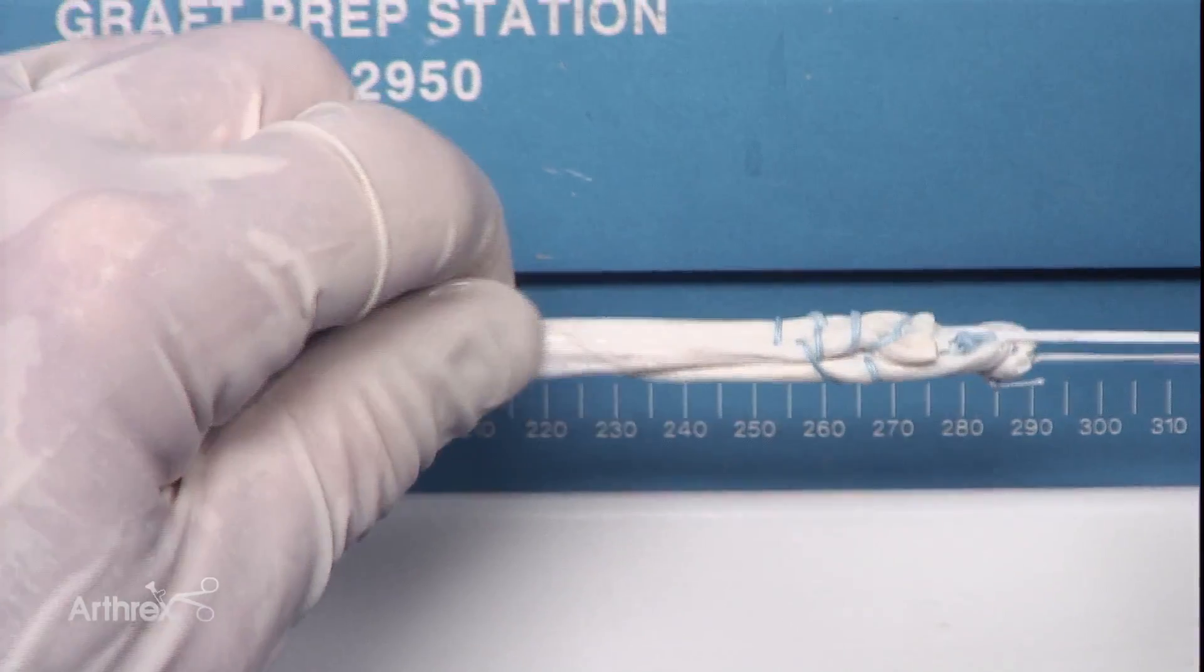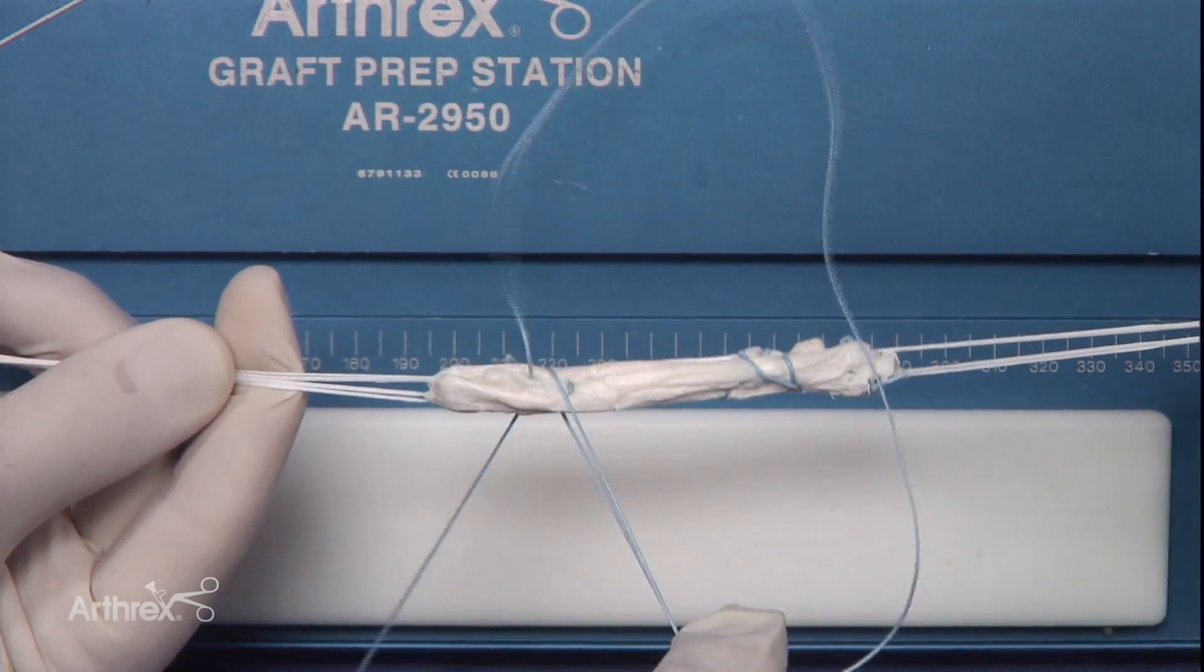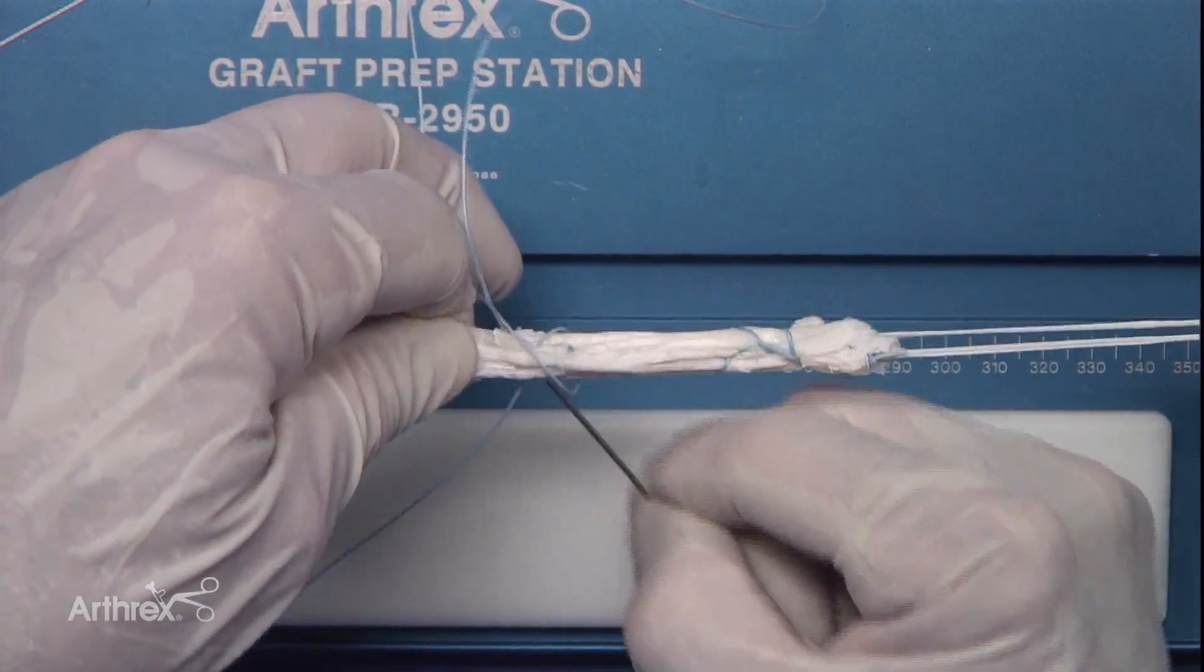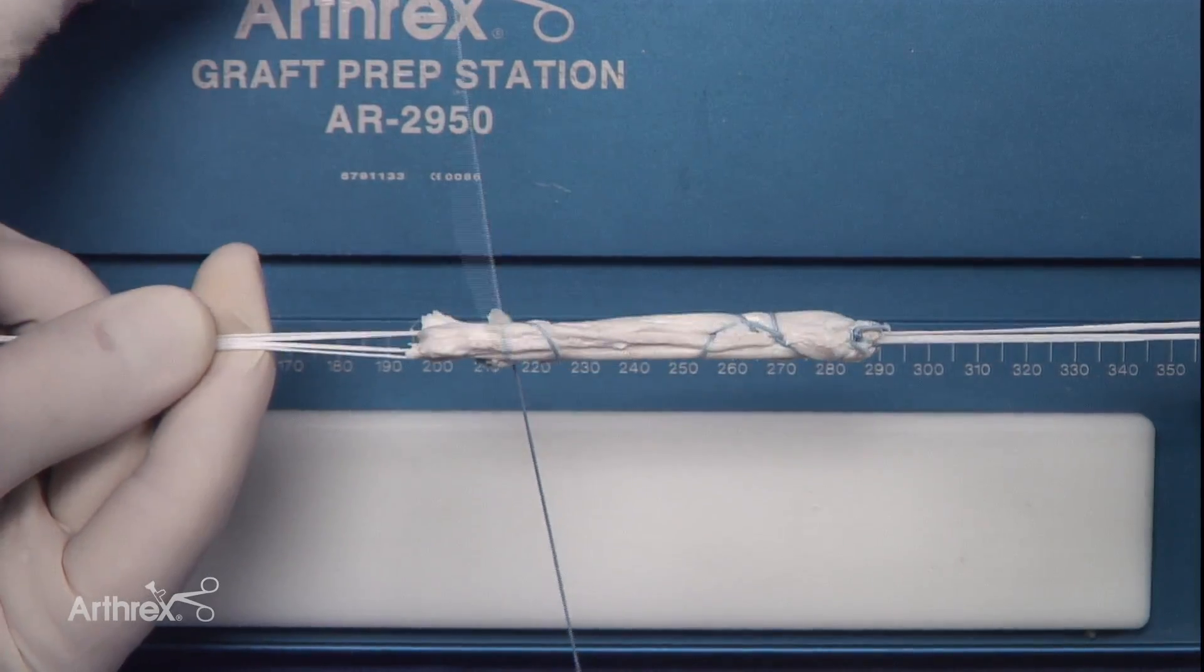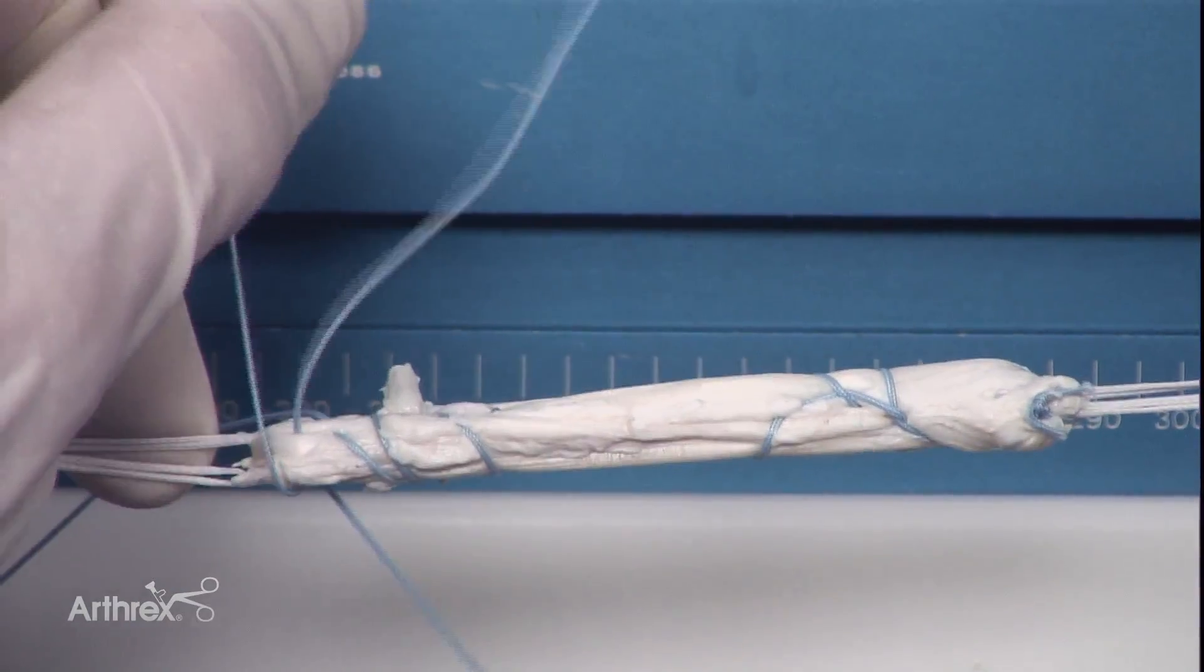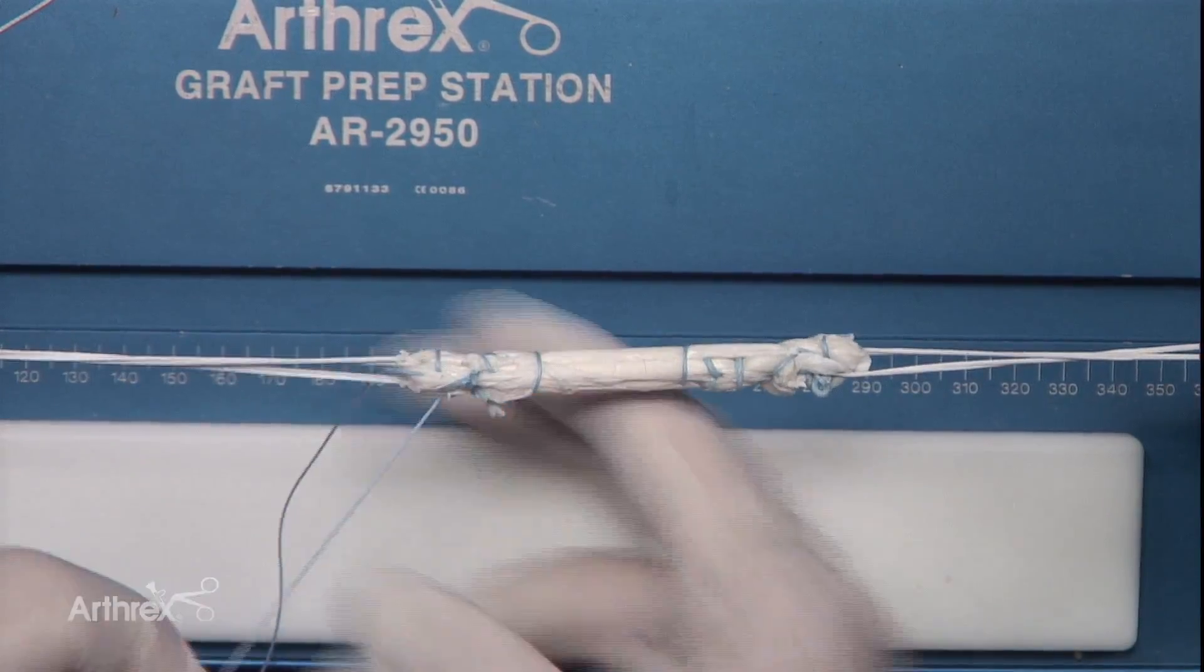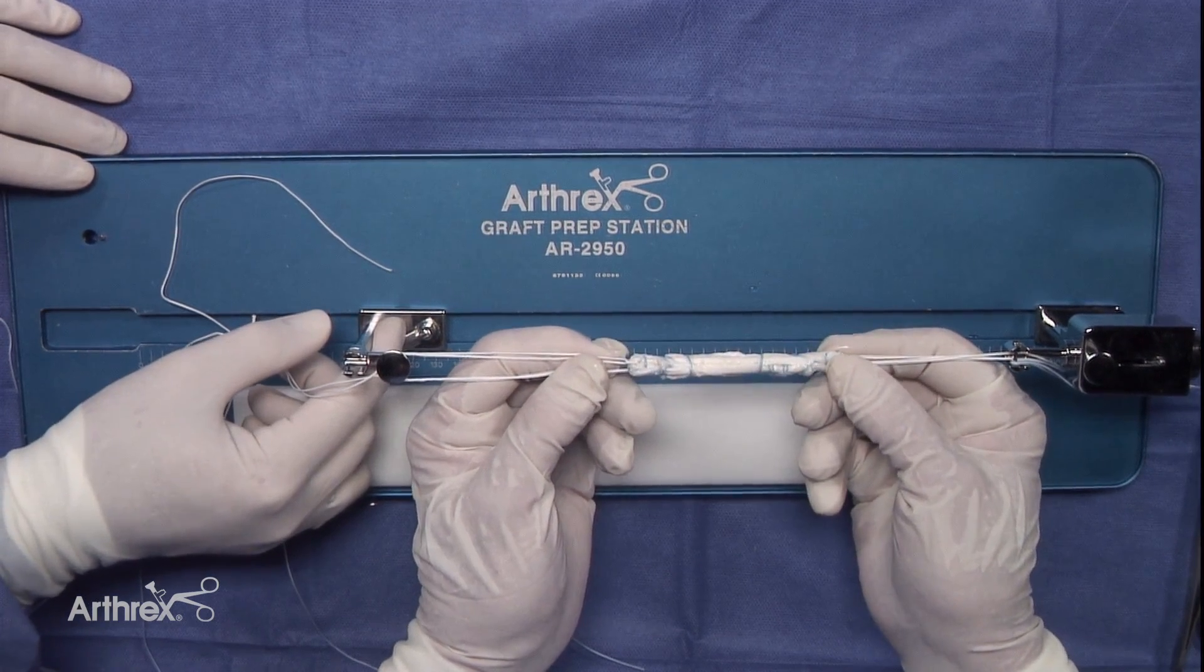Now we do the very similar thing to the opposite end. We're going to suture the other end again with the fiber wire. We're going to cross that, maintain our loop. We'll do a third one right at the end. We'll cut the end of that. So we have the final construct of the graft.